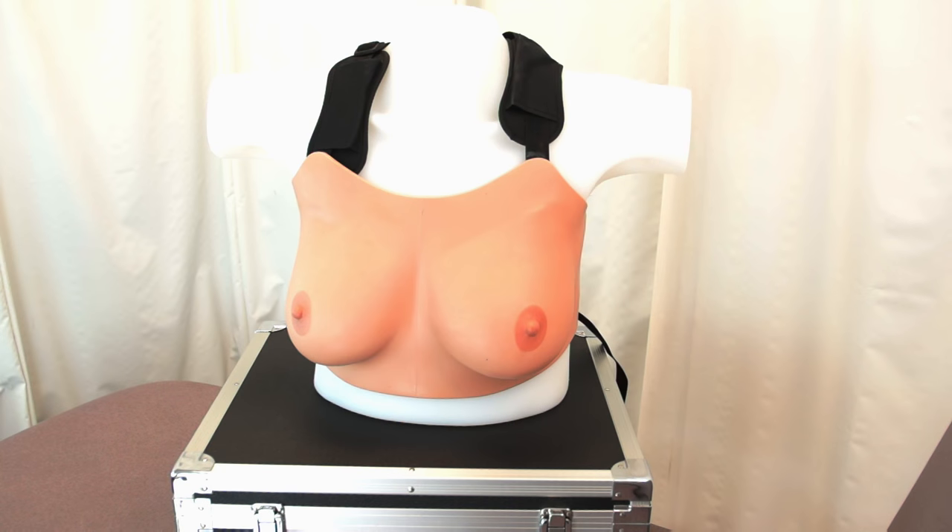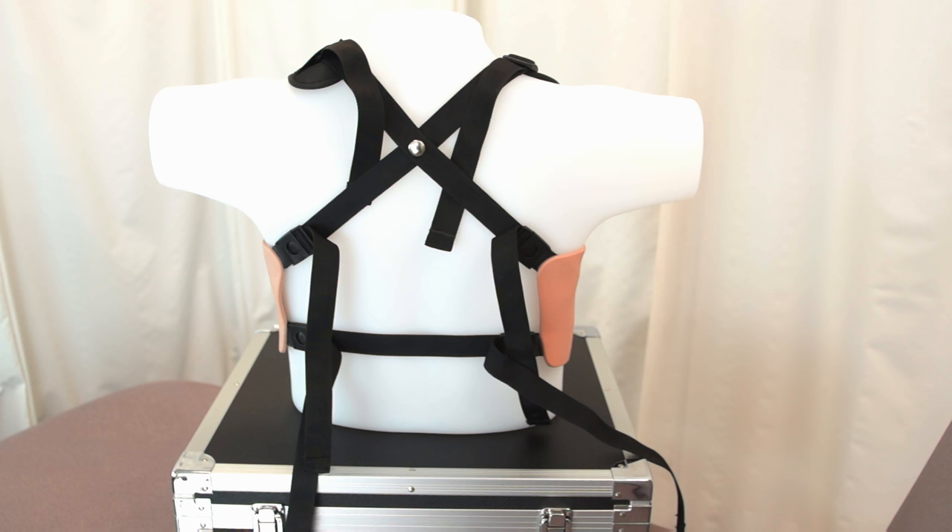Let's look a little bit closer at these models. From a training perspective, these models can be used on the torso themselves; however, they can also be detached from the torso and worn by an individual in order to facilitate a more effective breast examination. As will be shown in the separate breast clinical examination video, the actual positioning of the patient and the movement of their arms is vital to performing an effective examination.